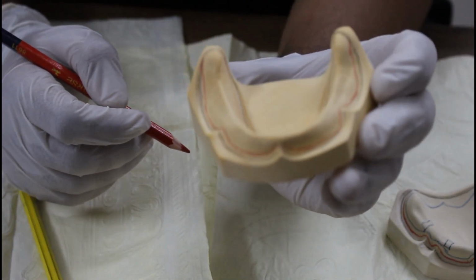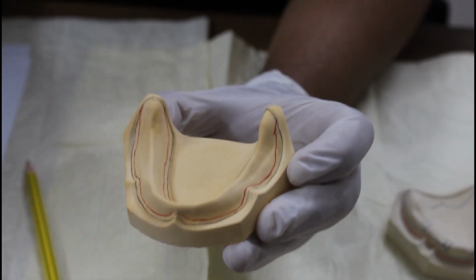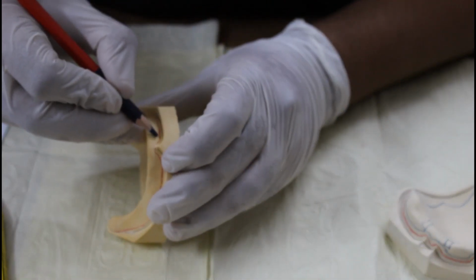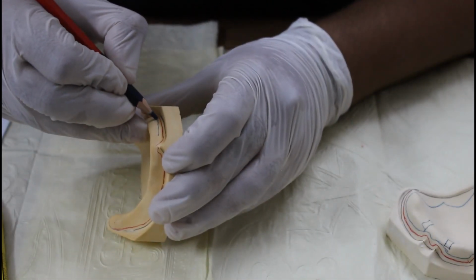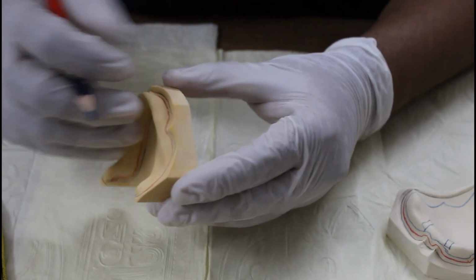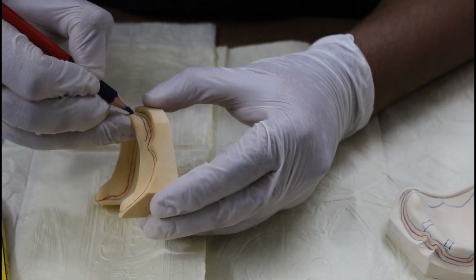So you have a tray line with the red color 2 millimeter above the sulcus line. Now take your blue color pencil, mark it 2 millimeter above the red color line. This is your spacer line.